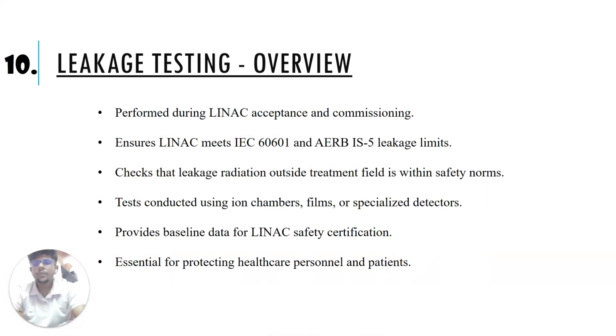Leakage testing overview. It is performed during the LINAC acceptance and commissioning to ensure the LINAC meets IEC 60601 and AERB leakage limits. It checks that leakage radiation outside the treatment field is within the safety norms. Tests are conducted using ion chambers, films, and specialized detectors. It provides the baseline data for the LINAC safety certification, essential for protecting healthcare personnel and patients.